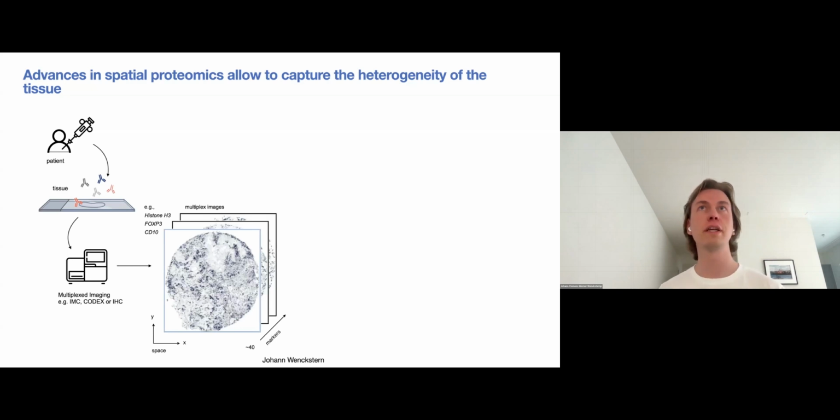It's a multiplex image where each channel measures the protein distribution of a single marker. So high intensity areas here in dark blue basically mean the target marker, in this case protein, occurs at a higher rate versus low intensity areas.